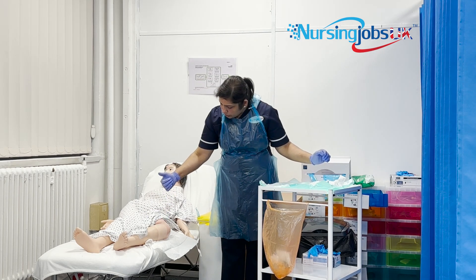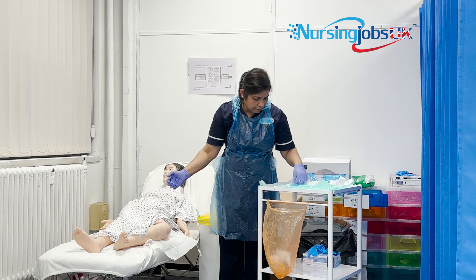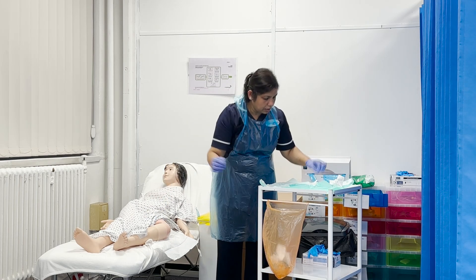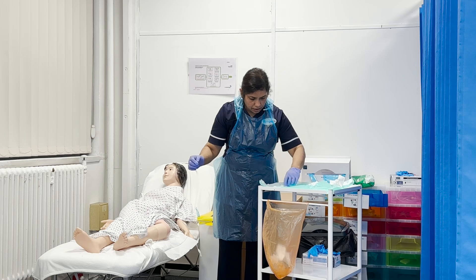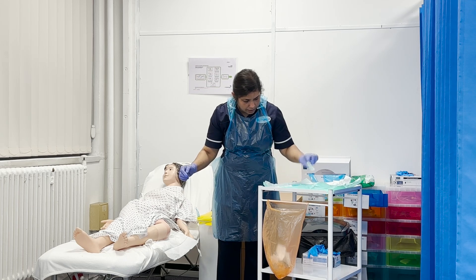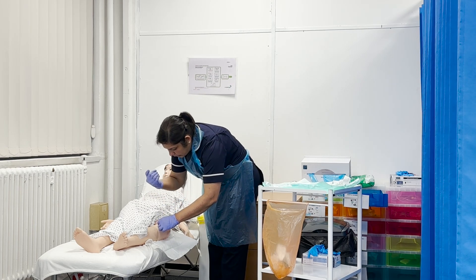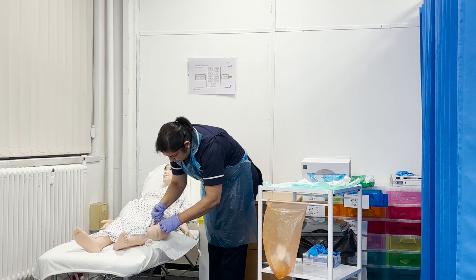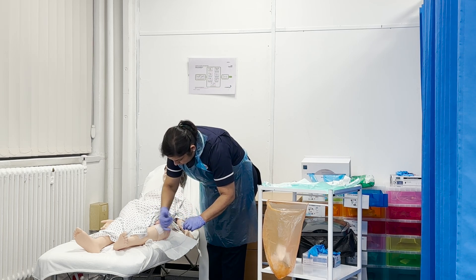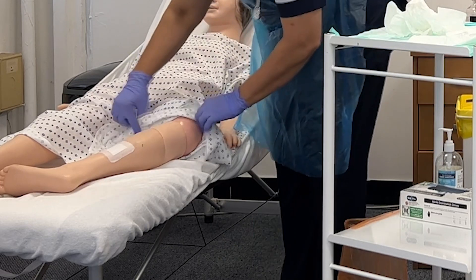Joe, your wound is clean and I don't need to do any more cleaning. I'm just going to dry it now — apply the dry pads. Now take your mepo dressing. It's better to open it with one hand. Joe, I'm just going to stick the plaster on now. Use the back of the other hand and apply without touching the inside of the dressing. The dressing is now complete.